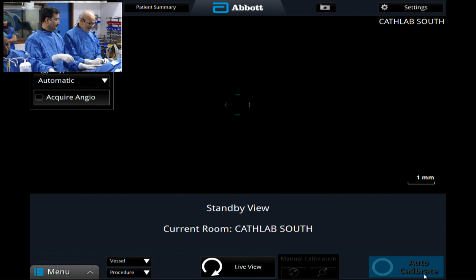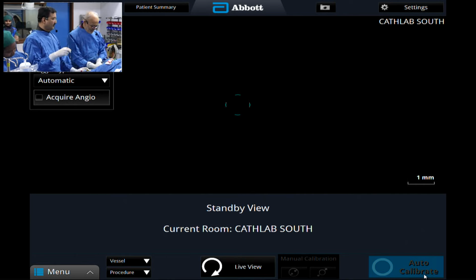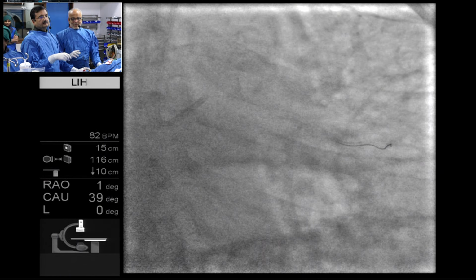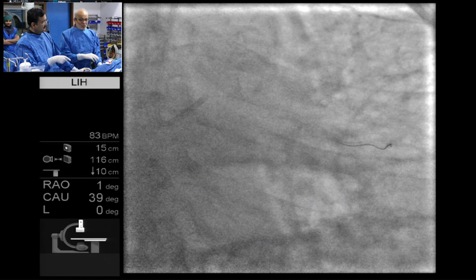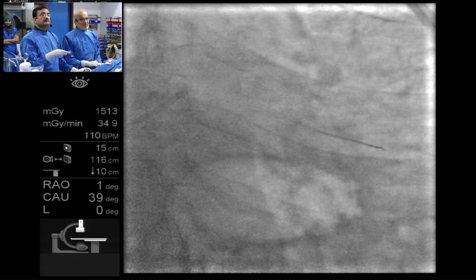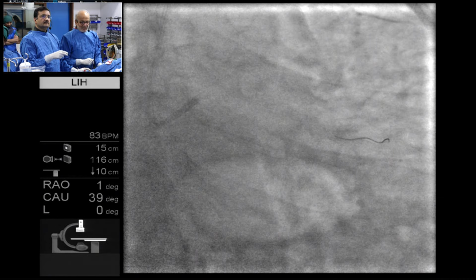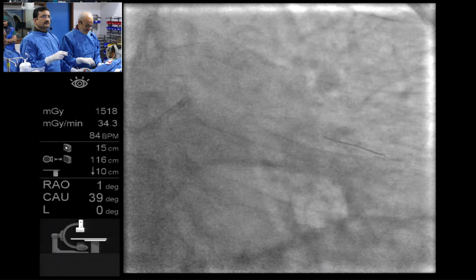In a calcified segment, when you see waist and when you are going high on the pressure, at what point do you really perspire? I think my focus is on the two edges of the balloon and the dog boning, because that's where the trouble is. If the waist doesn't go up to 20 or 22 atmospheres and then suddenly it opens up, I think of perforation first. I will deflate the balloon and inject. If I see perforation, I will inflate the balloon again and decide my strategy.